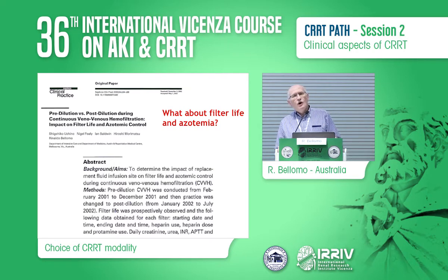I said before that if you do pre-dilution, you're going to decrease the efficiency of the system, but you might prevent hemoconcentration. If you prevented hemoconcentration, you might prevent filter clotting. You might decrease the risk of filter clotting.